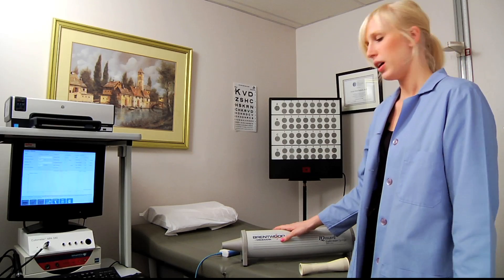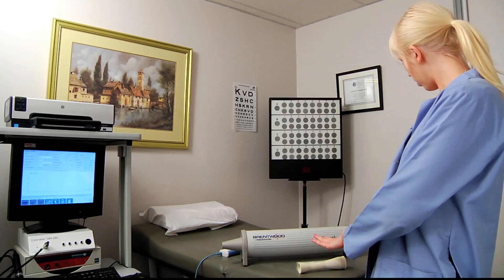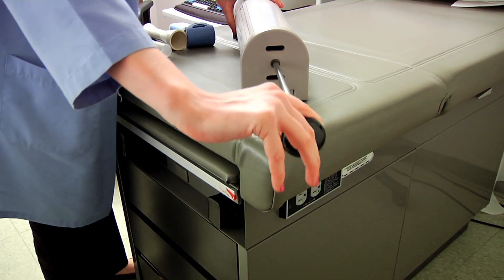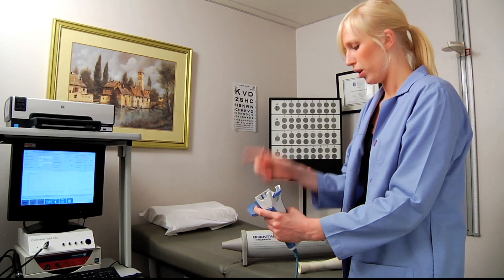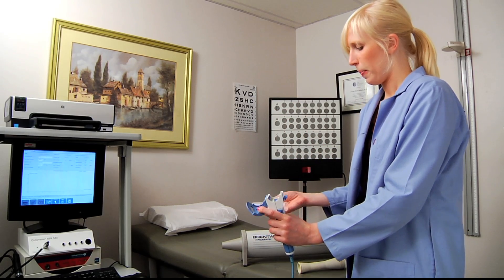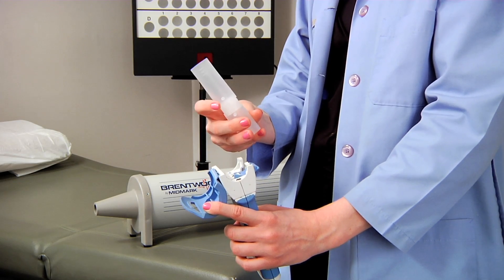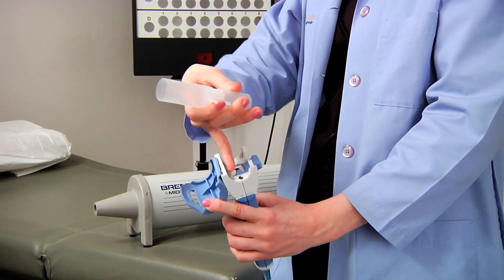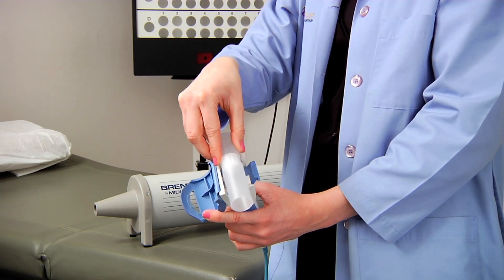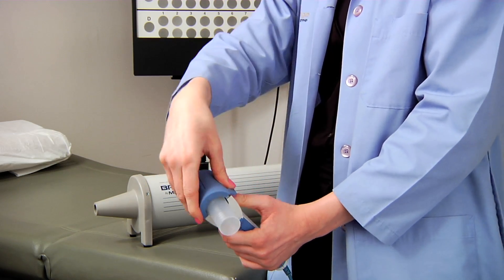We're ready to get our calibration started. The first step is to get your supplies together. The second step is to pull out this black syringe from the whole calibration syringe — now it's full of air. You're going to put the mouthpiece in the actual spirometer. It has two front prongs and one back prong — stick those two front prongs right into those two holes.